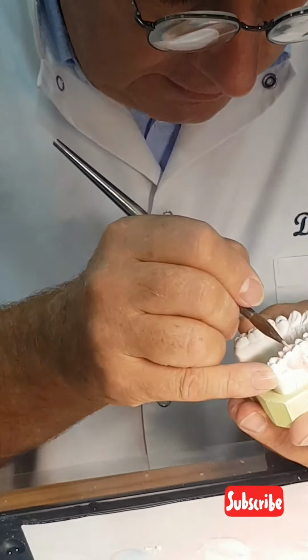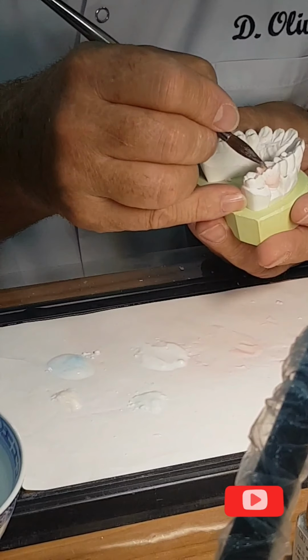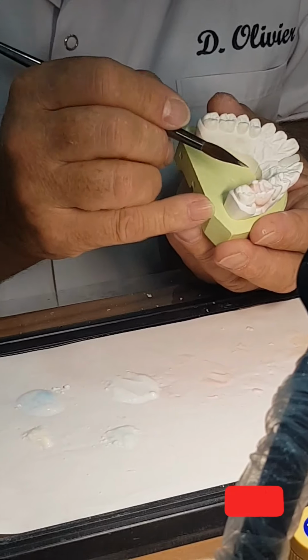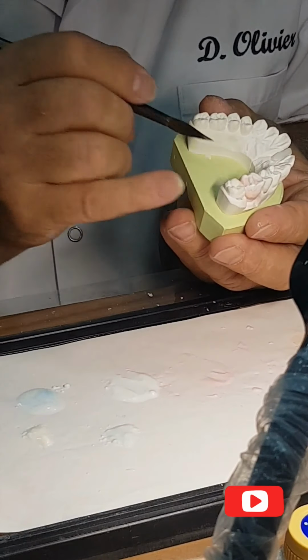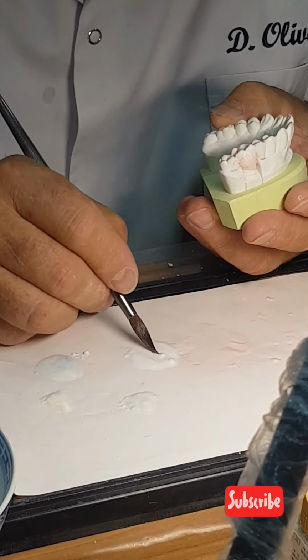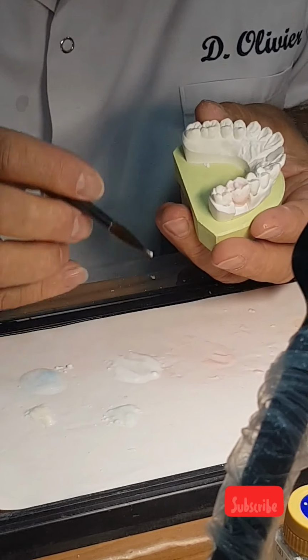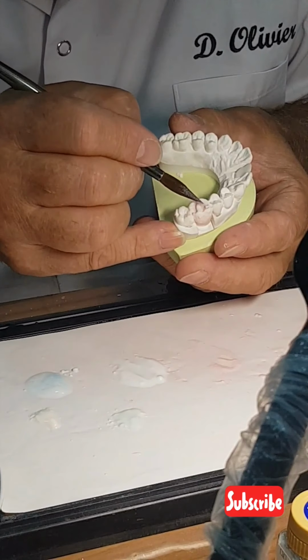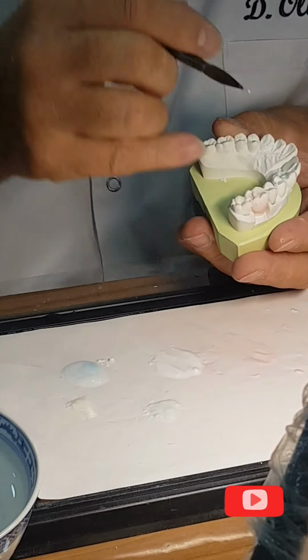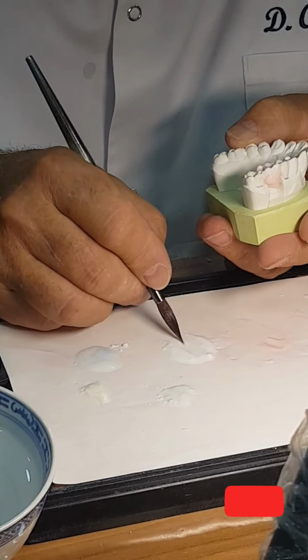I do that, in fact, with my translucent. Look, I draw the crest. I follow the organization of my dentine. Up is the crest, and I continued here. And just behind the dentine here, I put a small quantity of translucent, at first for support of the thin part of dentine, and second to give translucency just behind.